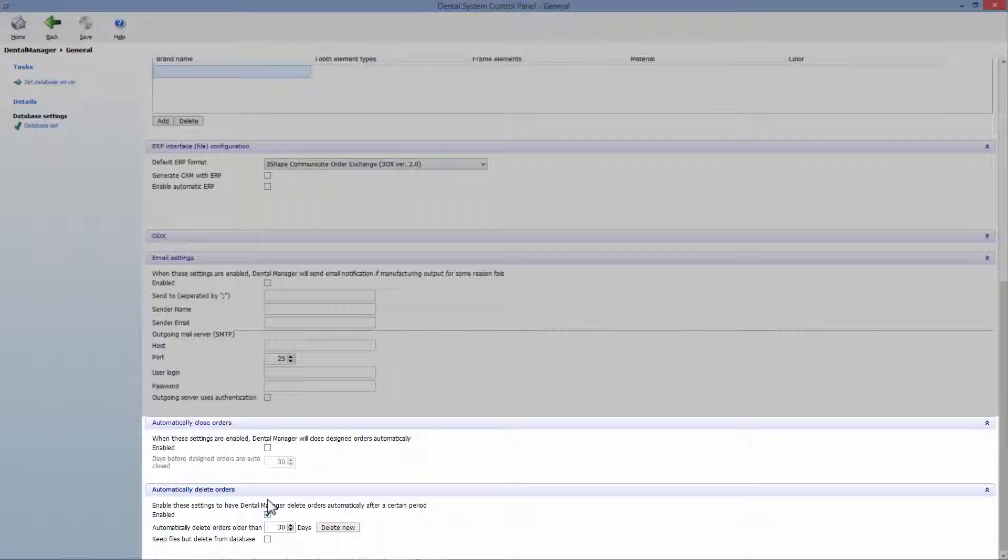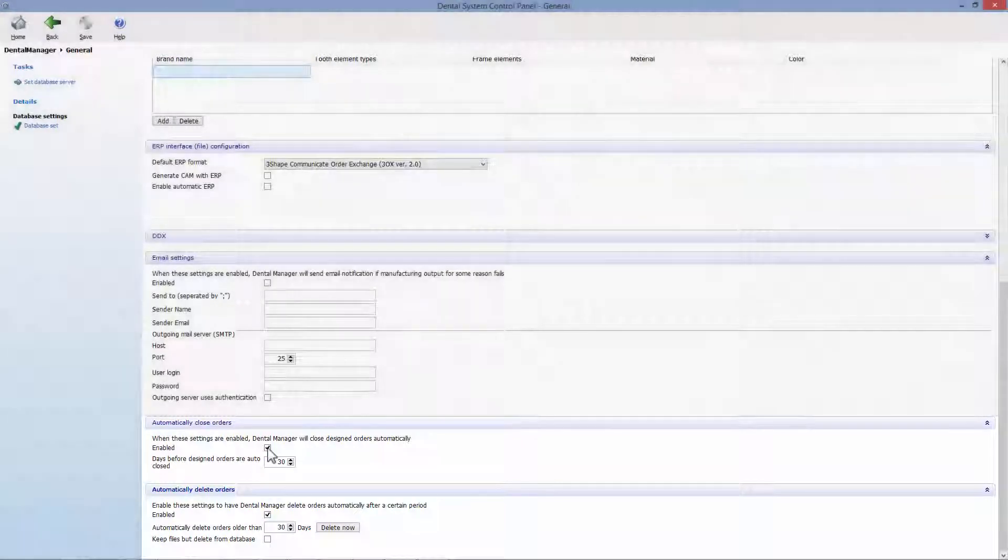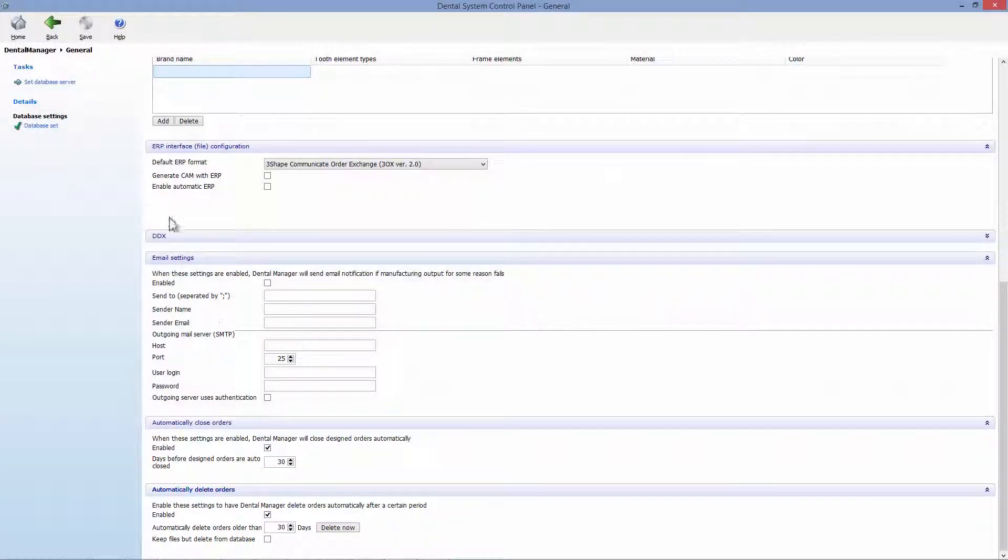You can also close designed orders automatically. After that, click save.